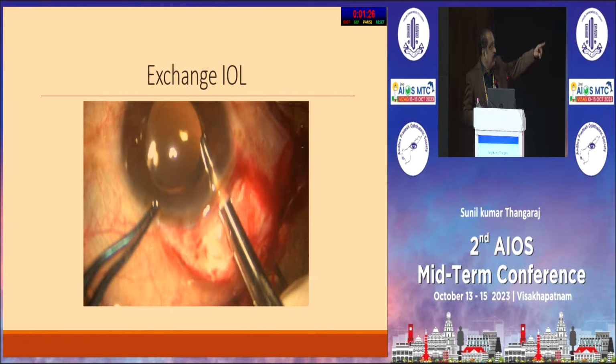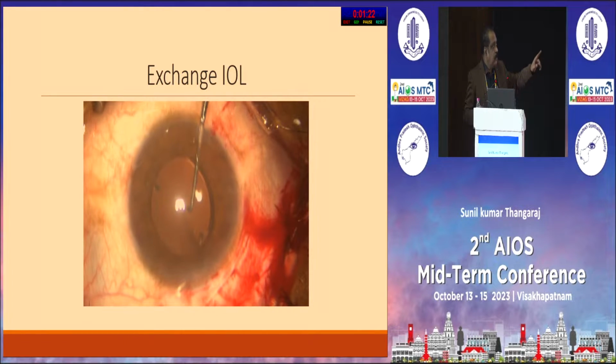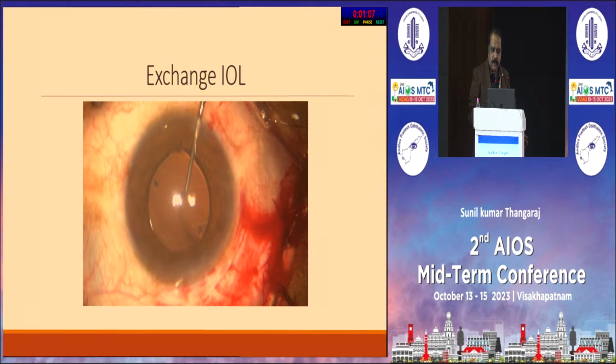So came out, now I put in. This is the best way to handle the situation. You know, cutting the lens intraocularly, trying to take it out through a small incision is all very nice to say. You can easily get out the vitreous. This is the easiest way: just put a small incision, get out the lens, put in your rigid lens.